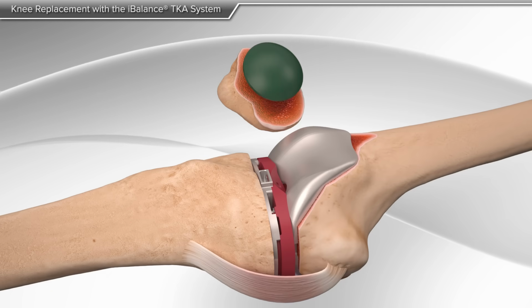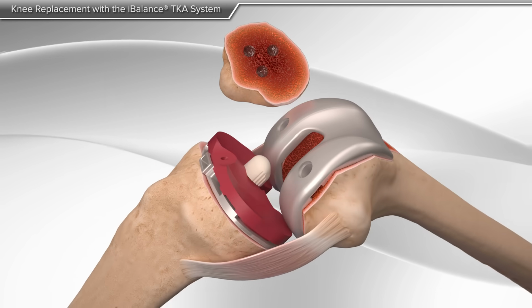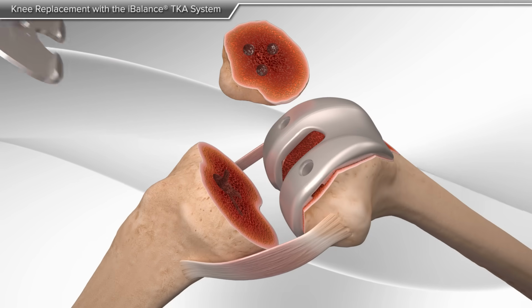The trial implants are then removed and the surfaces are prepared for placement of the final implants.